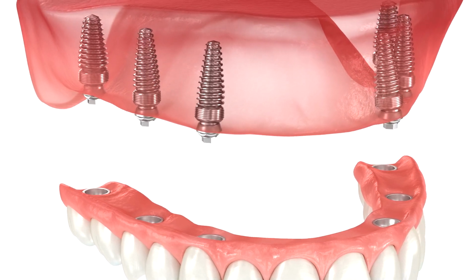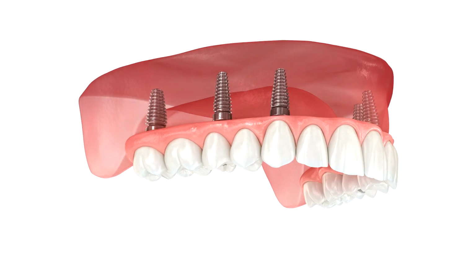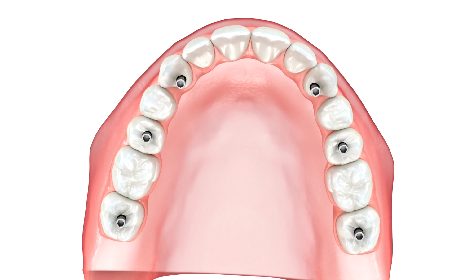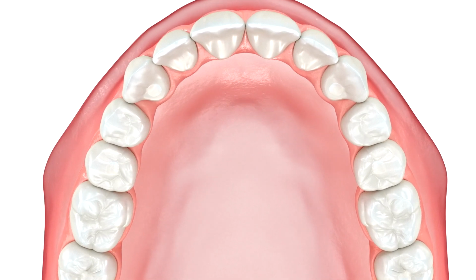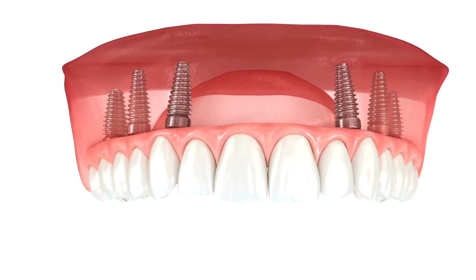Visual: show the microscopic difference in crystal structure. This strength difference becomes critical in high-stress zones, such as posterior molar replacements or narrow ridges. Grade 5 allows for the necessary resilience against fatigue fracture over decades of chewing. Visual: show finite element analysis simulation of stress on a grade 4 versus grade 5 implant.